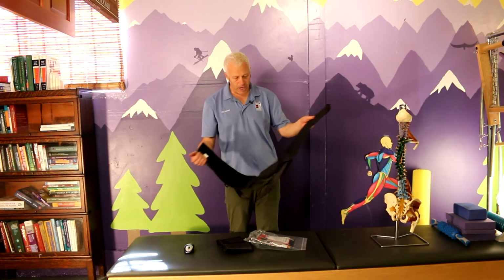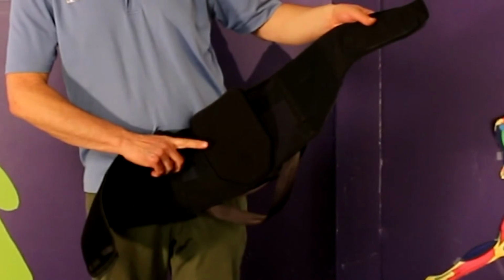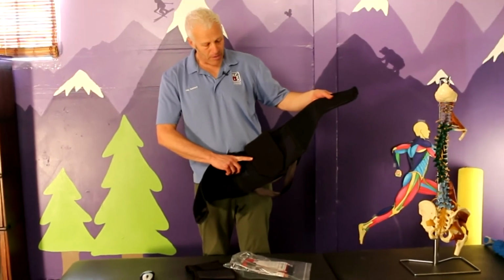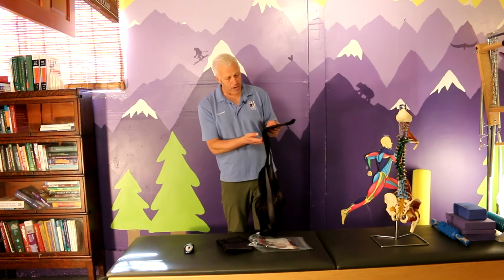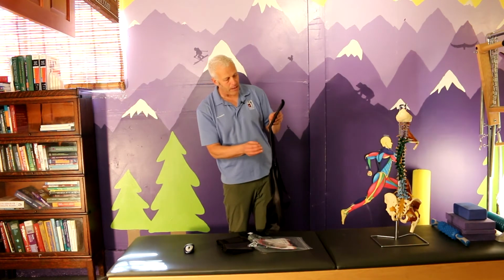This back brace will adjust up and down depending on your body size and where your problem is, and there's a Velcro that does that. And if you look here, there is an additional stabilization panel that fits on the inside.